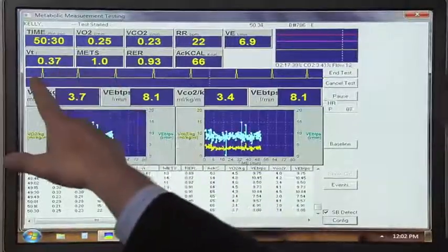Good morning. Really glad you could come to the laboratory this morning. We're going to talk about measuring the metabolic rate today. As you can see, Stephanie our subject is resting — she's been at rest for approximately 50 minutes — and we're measuring how much oxygen she is consuming and how much carbon dioxide she is producing, which are surrogate markers of her level of metabolism.